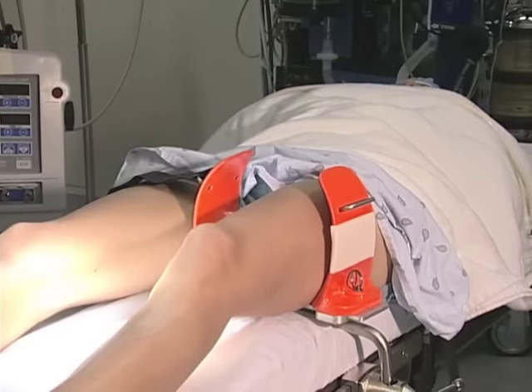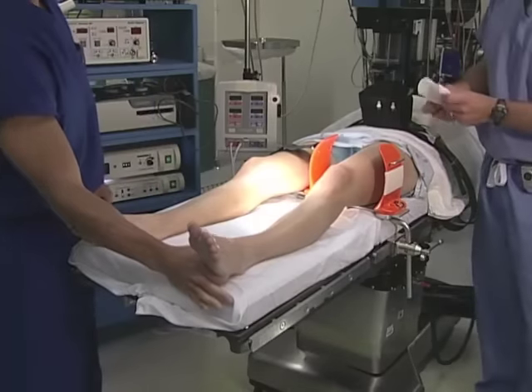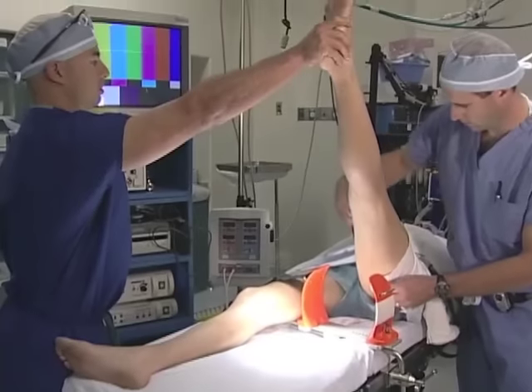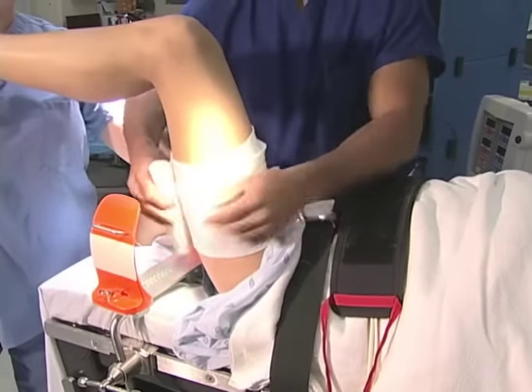After the patient is positioned, a safety belt is placed around their waist. Next, we will place the tourniquet. With an assistant holding the leg, we first wrap cast padding once or twice around the thigh, trying to avoid wrinkles.